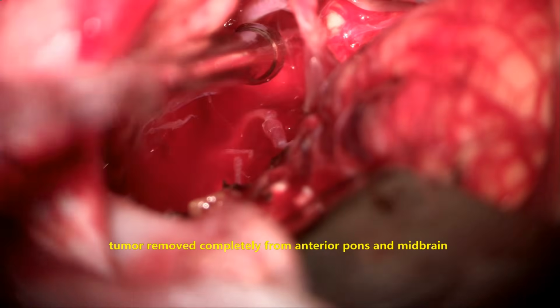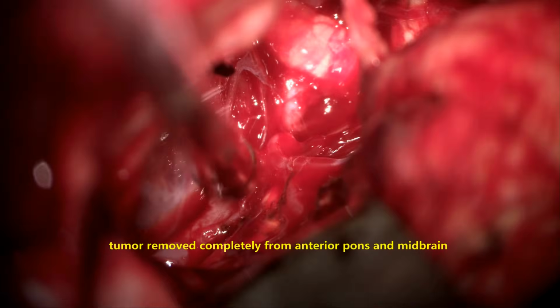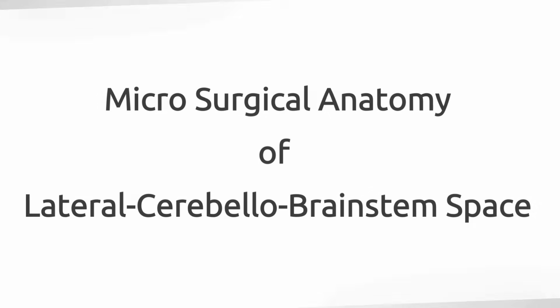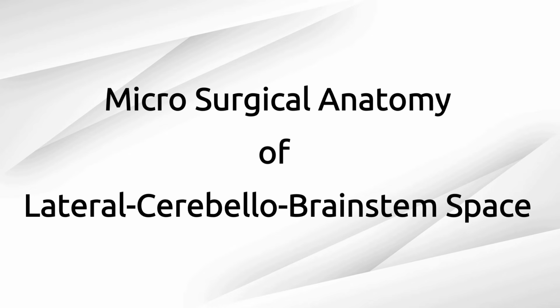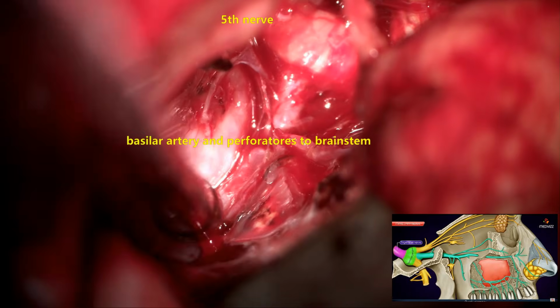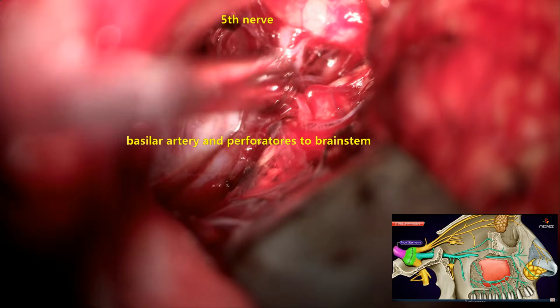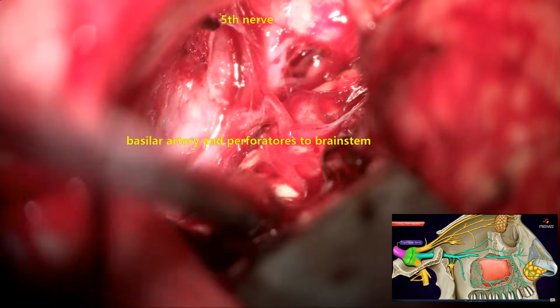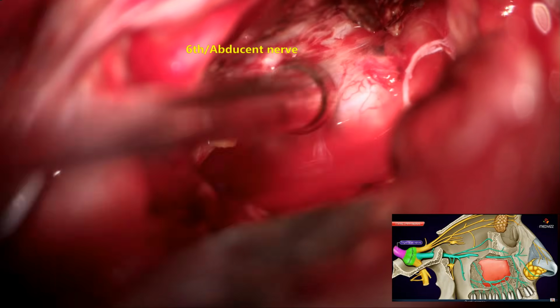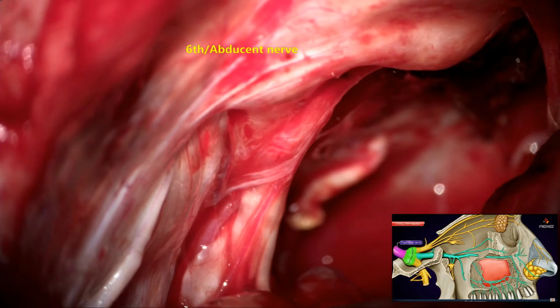Once that is done, you can see now complete removal of the lesion, and the superior and mid part of the trigeminal nerve is very well preserved and protected and seen coursing to the trigeminal canal. Now you can see the trigeminal nerve has shifted superiorly and anteriorly. And now you can see the basilar artery, the anterior lateral part of the pons and midbrain, and the perforators from the basilar artery. That's the sixth nerve, abducent nerve, entering into Dorello's canal.